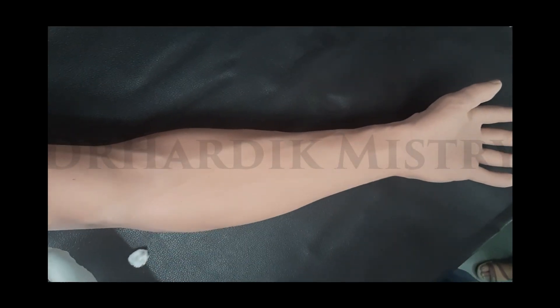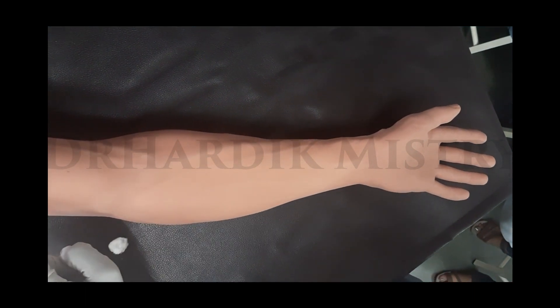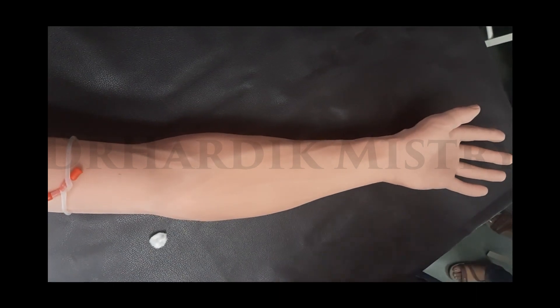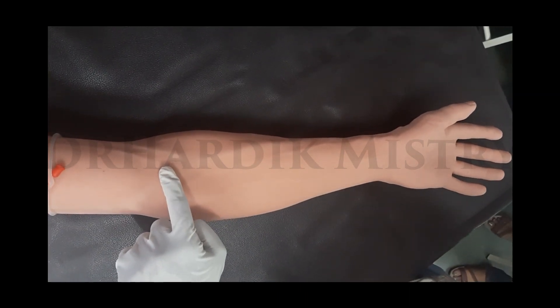First, we have to apply the tourniquet. Why do we have to apply the tourniquet? Because it is going to block the venous circulation from this hand, so it is going to drain the deoxygenated blood from this hand towards the heart. We apply the tourniquet so that it will block all the venous circulation. Once the venous circulation has been blocked, whatever deoxygenated blood is present inside these veins will be accumulated inside the veins.